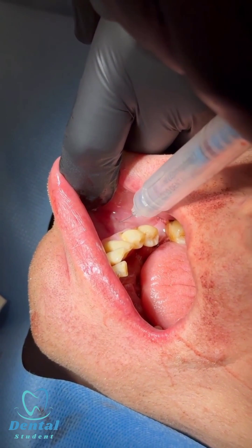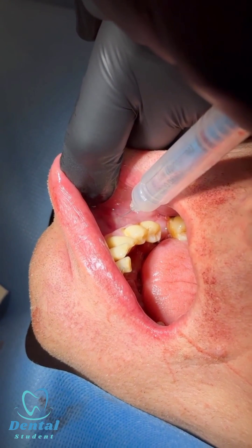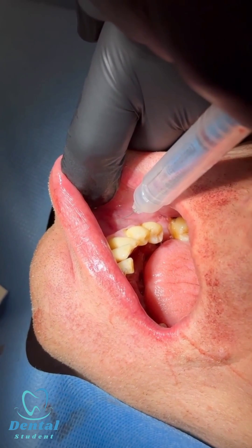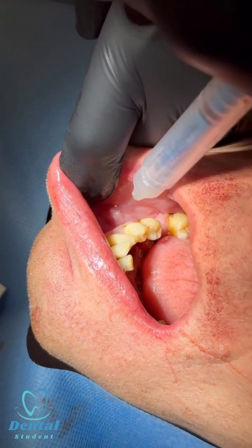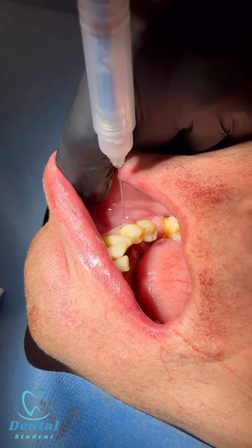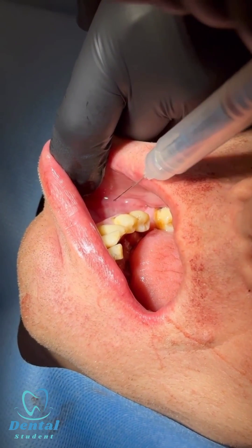Use the long needle and inject for the mental nerve nice and slowly. This is as opposed to infiltration — with infiltration, the needle is directed toward the apex of the tooth, whereas for the mental nerve block, it is parallel to the tooth.